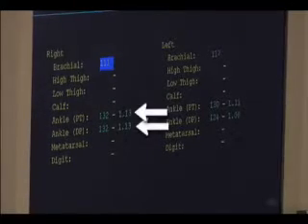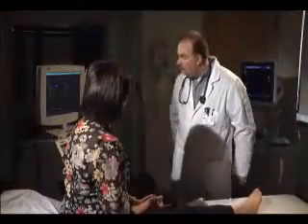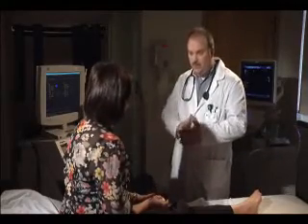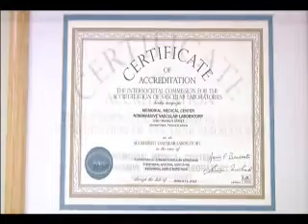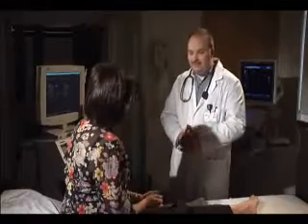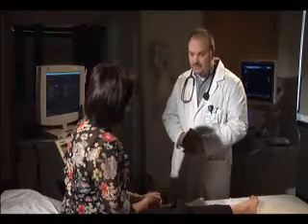Anything above 0.9 is a normal finding. Yours is 1.1 on both sides, so you're completely normal. We'll have a vascular surgeon review the results, confirm what we found, and send this out to your home. You should receive those results in about a week. We are an accredited screening vascular laboratory — one of only three in Pennsylvania. We've met or exceeded a high list of standards set forth by the Inter-Societal Commission for the Accreditation of Vascular Laboratories, abbreviated ICAVL, which is the world's leading accreditation agency for vascular studies and procedures.